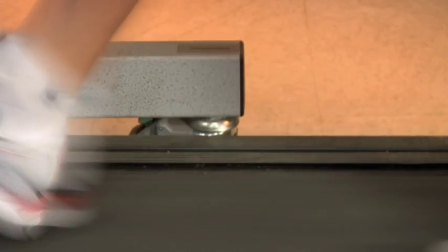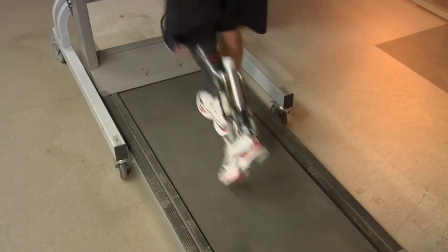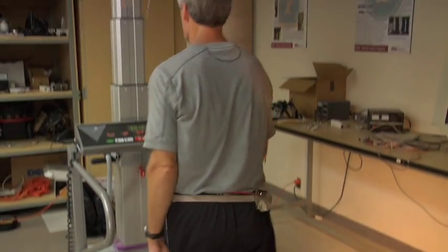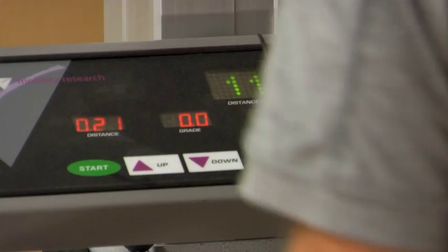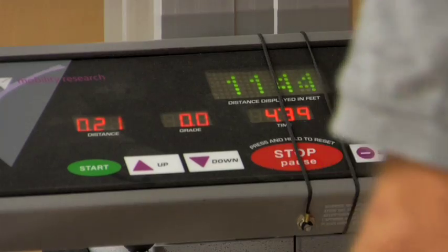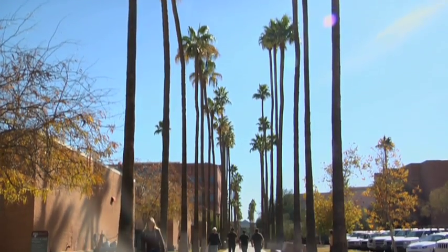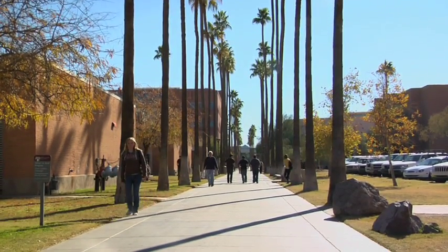We know we're complete when we can restore natural walking — walking to and from the store, walking up and down stairs. That's one of our main goals. The second goal, ultimately, is when the soldier could return to active duty.